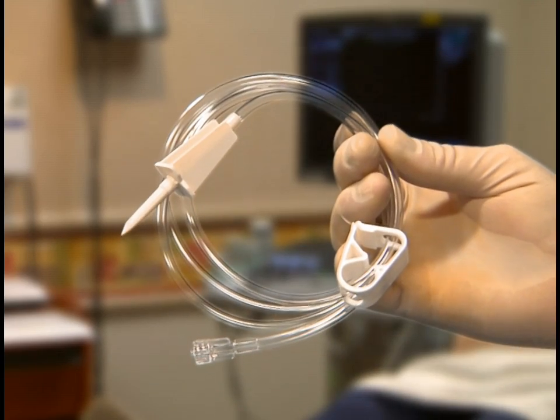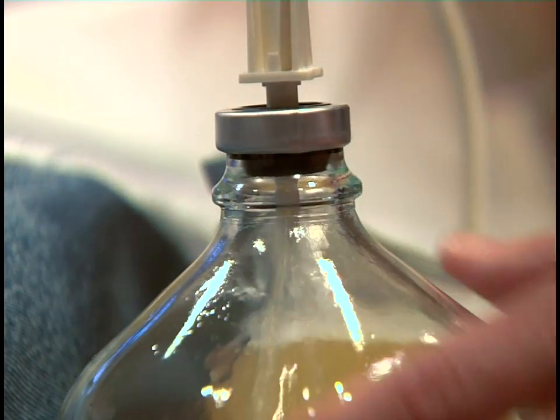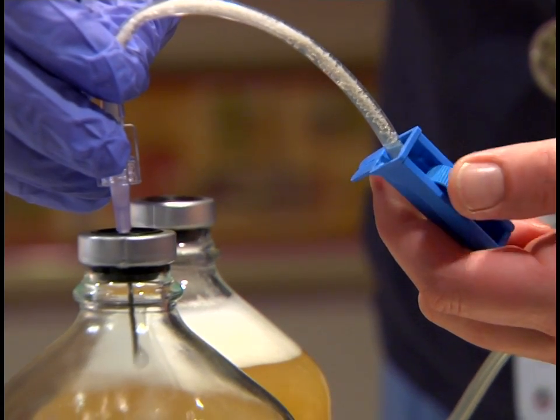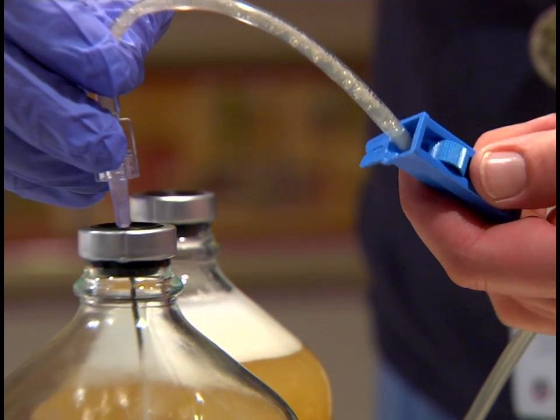For faster flow, the TAPS comes with a large bore tubing set with a large bore spike and pinch clamp. And to better control flow, the second large bore tubing set has a 16 gauge needle and roller clamp.